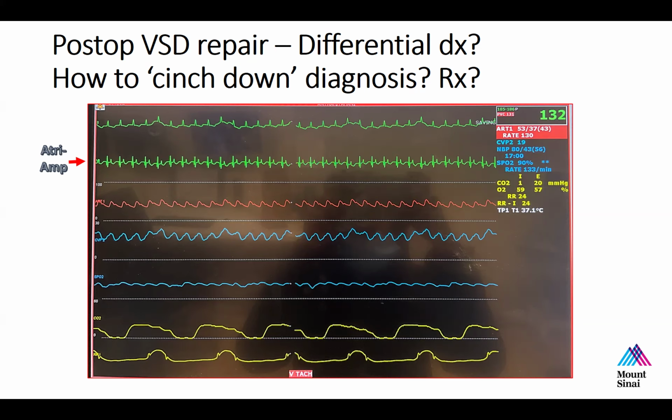But that could be easily ferreted out on an electrocardiogram, because if we were in sinus rhythm with a long PR, the P wave should be upright in leads 1 and 2 and aVF, just like a normal sinus P wave. And so it would be probably very obvious if the person was in sinus rhythm, based on the 12 lead.